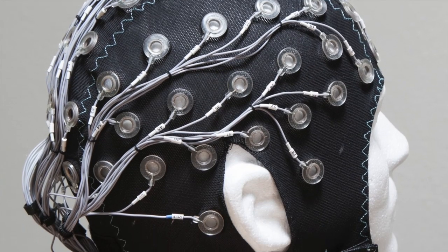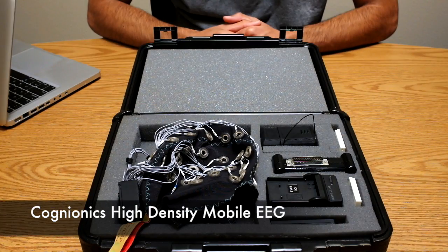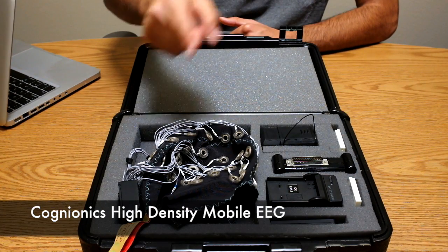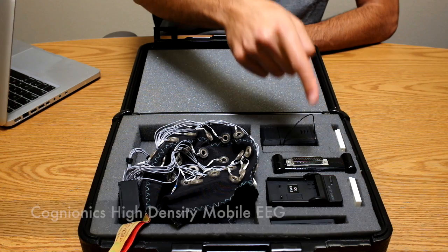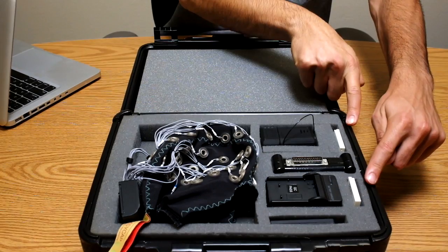This is the Cognionix high-density mobile EEG platform. The system includes an EEG cap, amplifier, wireless trigger, receiver, and batteries.